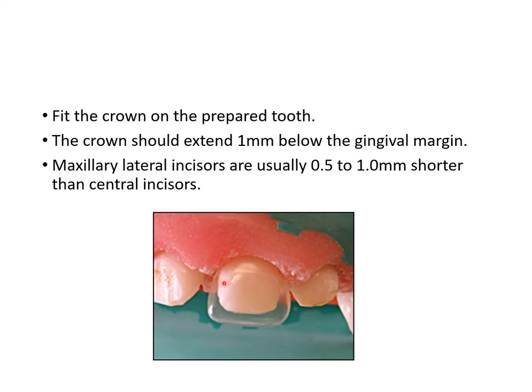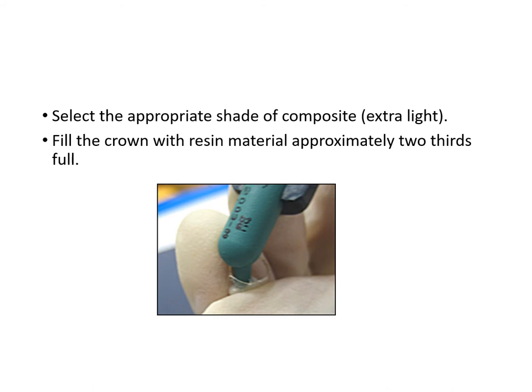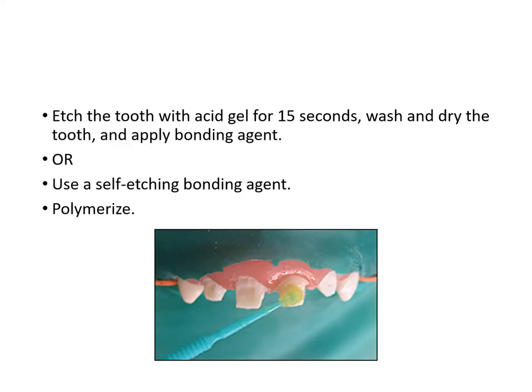Fit the crown over the prepared tooth — you should see a uniform space all around, which will be occupied by composite resin. Ensure crown margins are approximately 1 millimeter sub-gingival so the transition between composite and tooth is not visible. Select the appropriate shade — extra light is recommended. Fill the crown with composite resin approximately two-thirds full to avoid air bubbles. Then etch the entire tooth surface and apply bond, and polymerize the prepared tooth ready to receive the crown.